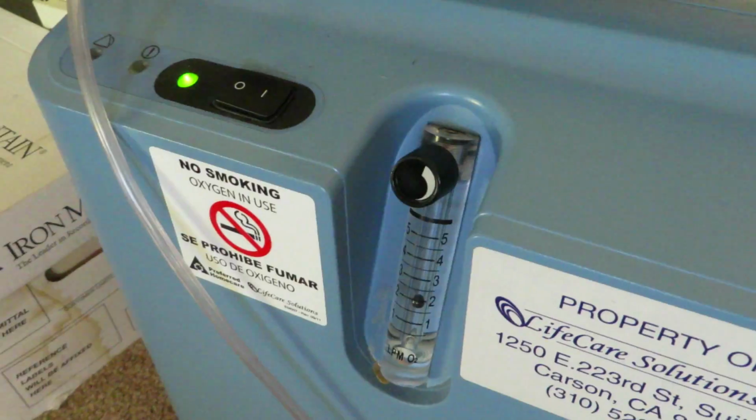I'm currently on 2. The way that they measure how much oxygen you're on is through liters, which is the same thing with water. It's just a way to measure things that aren't solid, right? And it pretty much means you're getting 2 liters per minute. So 2 whole liters are being delivered through the tube. Doesn't always mean that you are breathing in the 2 liters. Obviously, I'm not sitting here going, I'm talking and all of that. So it's really more like 1 liter per minute if you're actually measuring the amount that you're breathing in.